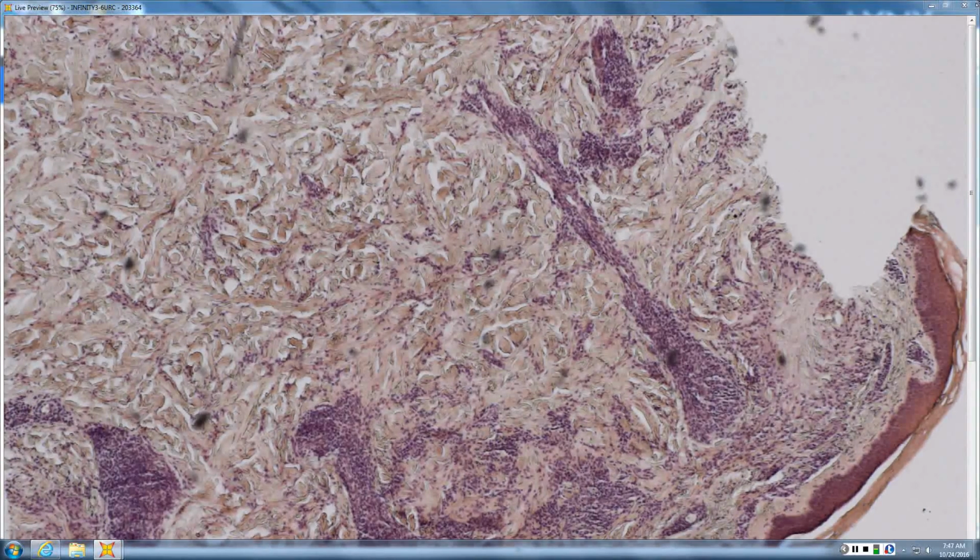More of them have few lymphs. But even if you have dense perivascular lymphs and interstitial granuloma, that's still okay for GA. You normally shouldn't see neutrophils, right? Is that how you can distinguish PNGD? PNGD has many more neutrophils, although you can see some neutrophils in GA in the center of the palisaded granuloma.